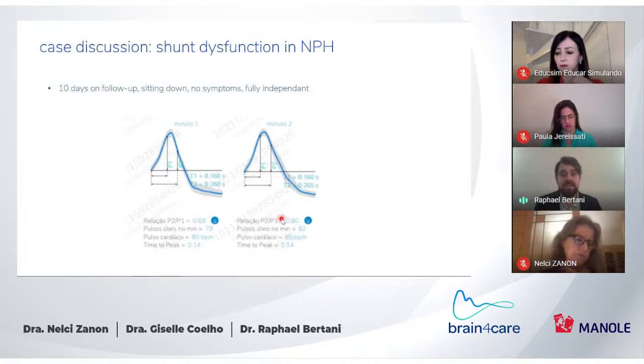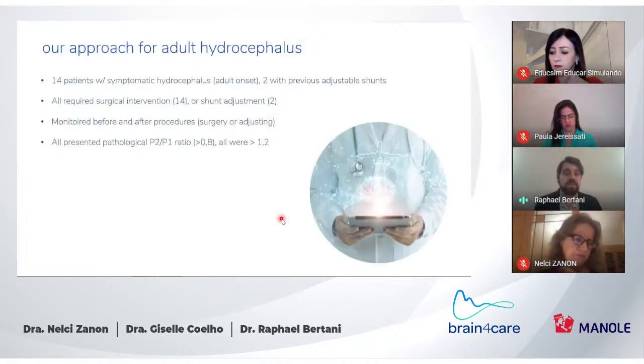And how did we get to this? How did we learn how to use the device? So how do we train ourselves, not only with the help of the excellent team from Brain4Care, but we also did ourselves a small study.